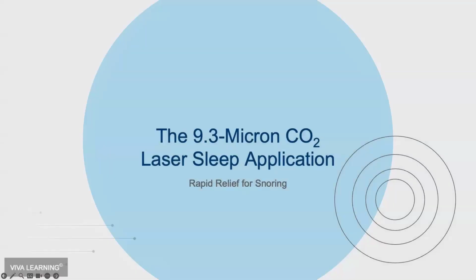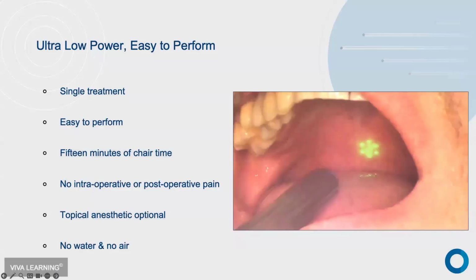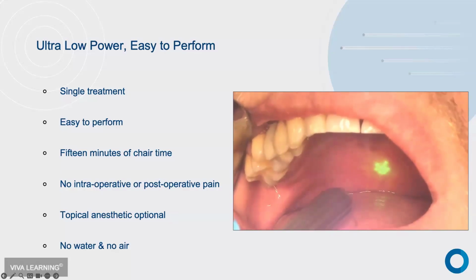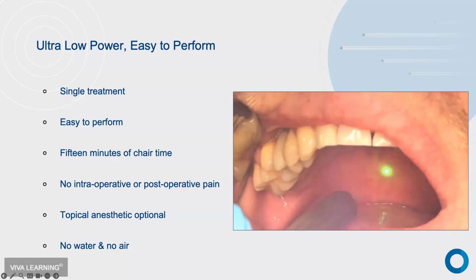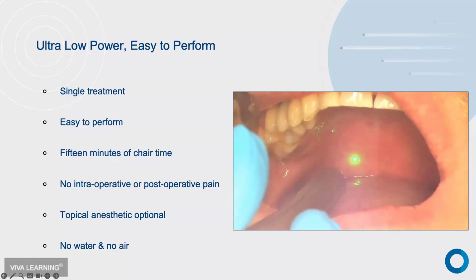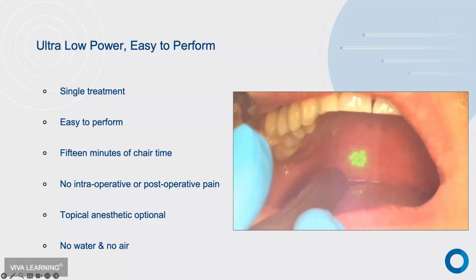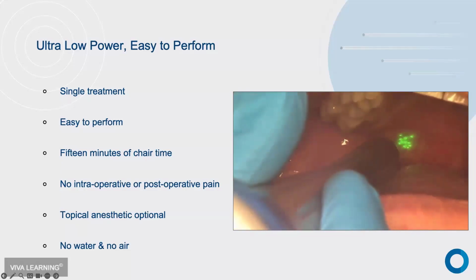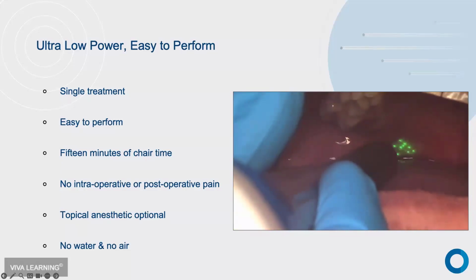I'm going to get to some of the questions in the last 5-6 minutes we have, but just to throw a couple more things out there. You remember that video of the collagen contracting? There's a newer handpiece that's a non-ablative cut. It doesn't cut like you saw. There's no de-epithelialization. It's just basically shrinking collagen. And basically it helps to tent up that palate, whereas a lot of snoring is because the palate is sort of falling, the uvula is sort of falling back. You see this person's opening, you could hardly even see their throat.